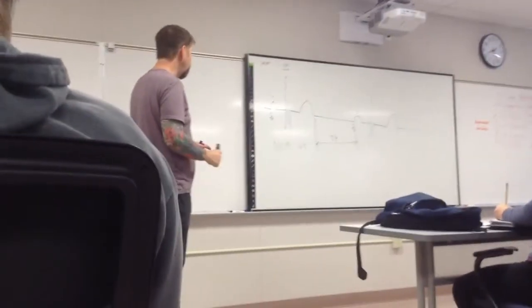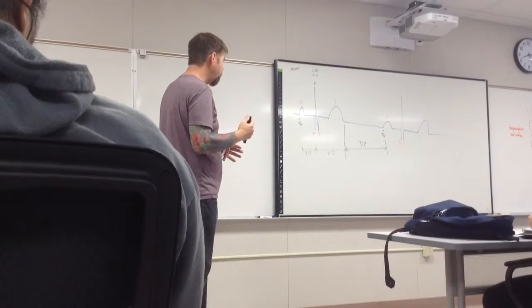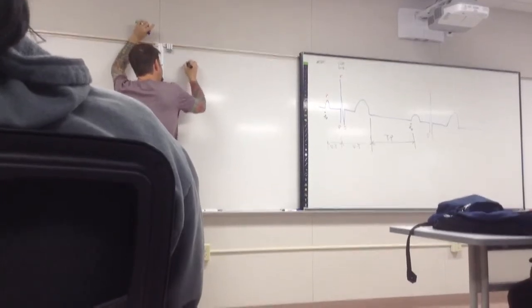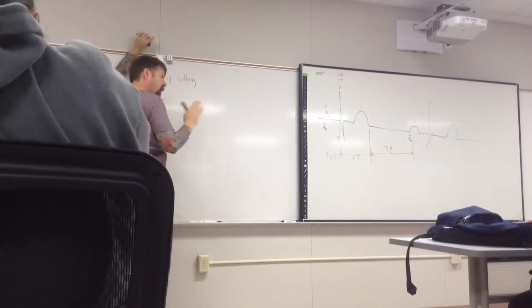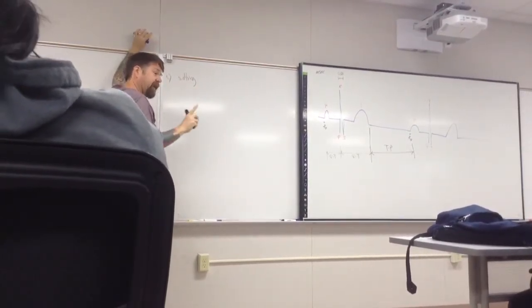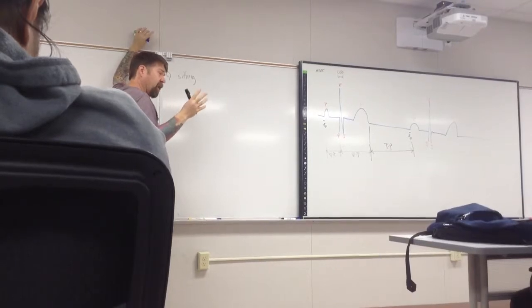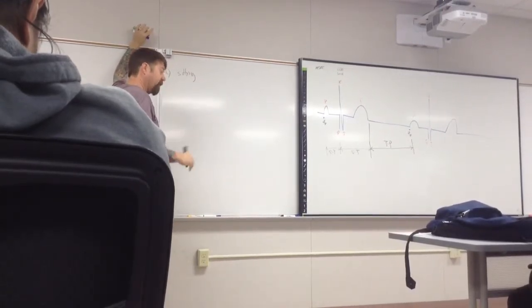So what you're going to be doing every time we do this, and this is the order within which I would do this, I would do the sitting first. You're going to have to repeat this experiment 5 times to get all the data we need. It has to be the same test subject each time. You're going to be working in groups, and we really only need 1 person per group to do it. It takes a while to run them through everything.